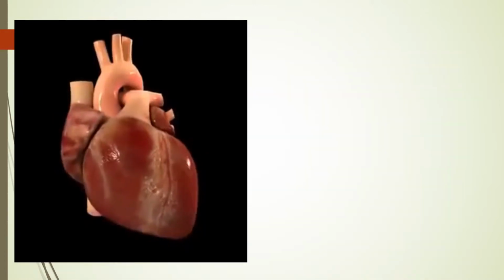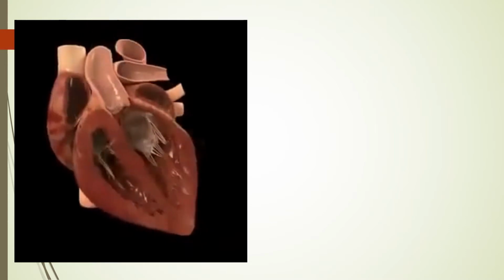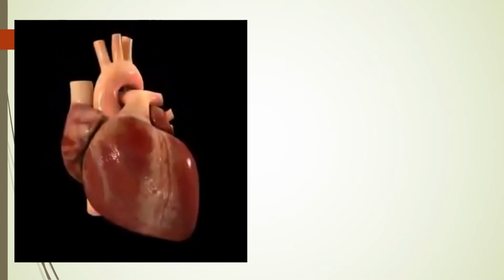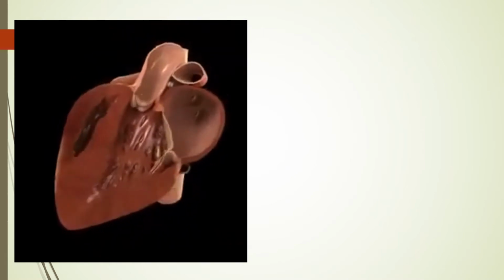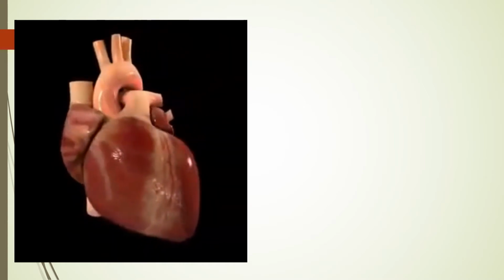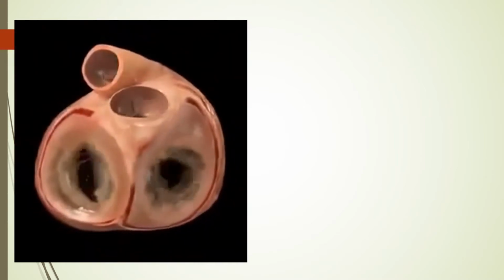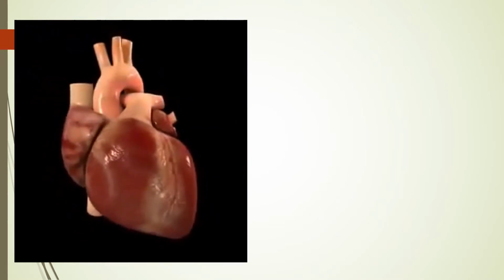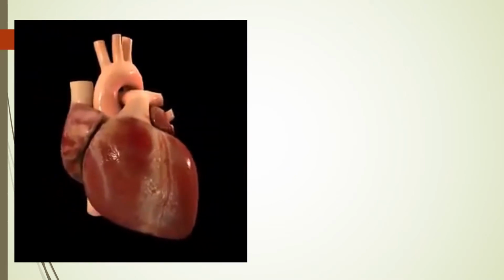When you take the client's blood pressure, you are measuring the force of the blood flowing through the arteries. There is always a certain amount of pressure in the arteries. This is because the heart, by pumping, is constantly forcing blood to circulate. The amount of pressure in the arteries depends on two things: the rate of heartbeat and how easily the blood flows through the blood vessels.